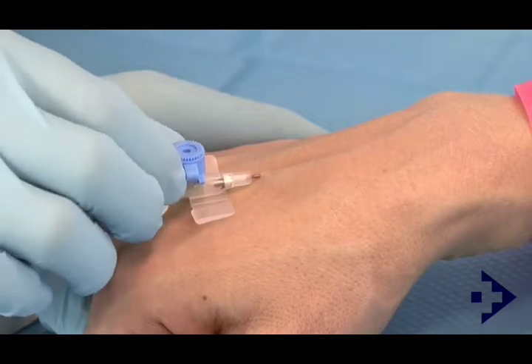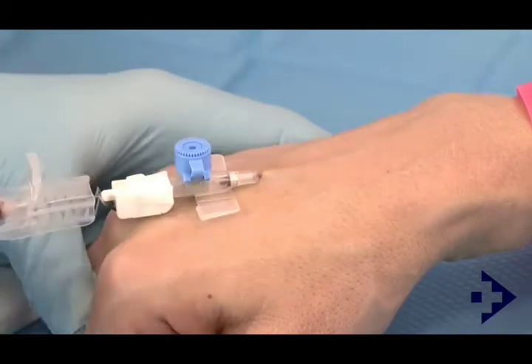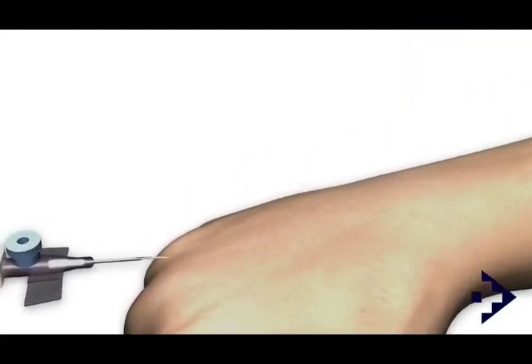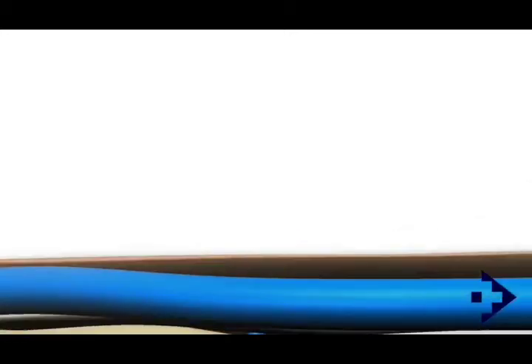After seeing the flashback, it's important to lower the cannula and reduce the angle of insertion before advancing the needle any further.